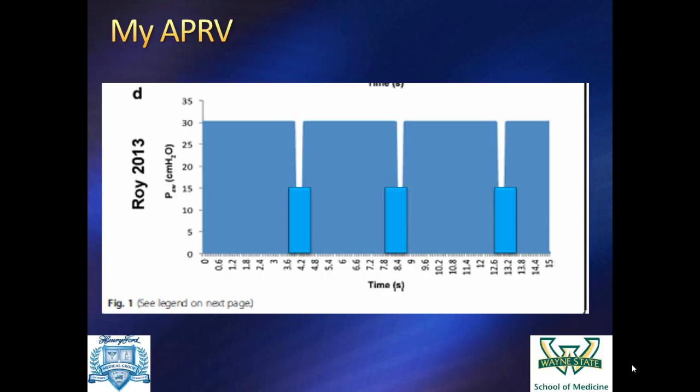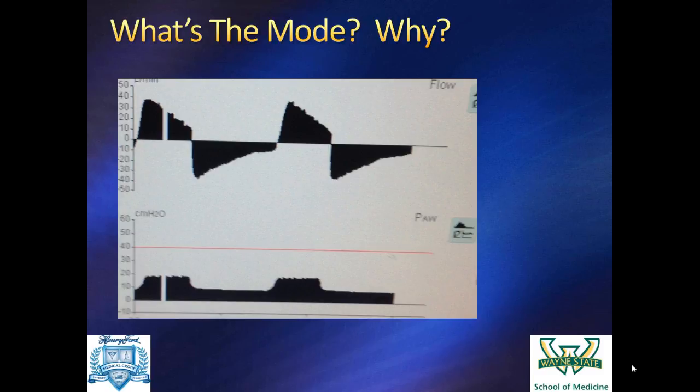That's not helpful for all the comers. We know that there's a variety of interventions we have for ARDS that improve oxygenation that don't improve outcome, but when you have somebody with a PO2 of 50, it's probably useful to know what will get your oxygen up, and this will get your oxygen up. I don't think there's any question about that. All right.